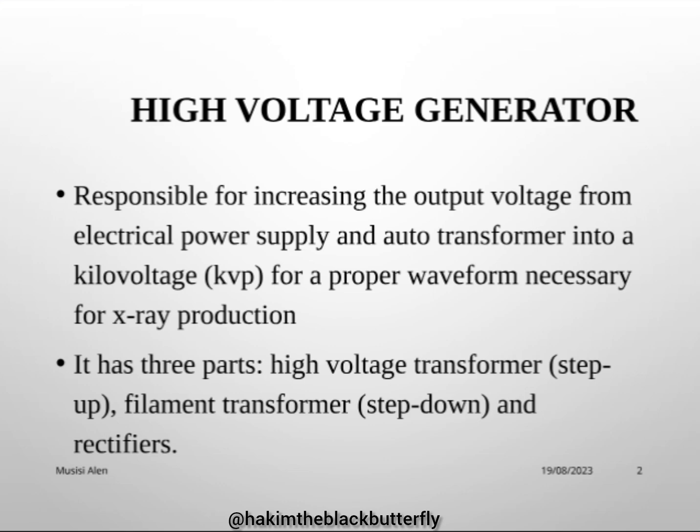Then the X-ray tube as a whole has its own circuit also. That circuit has a high voltage transformer that steps up the voltage to kilovolts. And also the mA that you feed into the machine is fed in by that circuit of the X-ray tube.